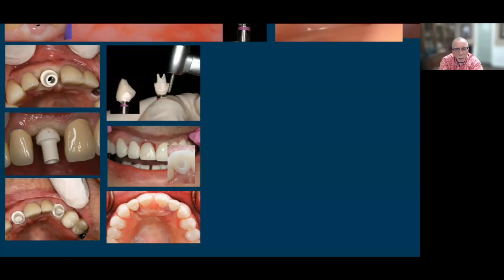And this is kind of a workflow of that, right? It was a plastic part, you kind of mark the margin. You have to polish these things really, really well. You don't want anything not highly polished against the tissue as it heals.